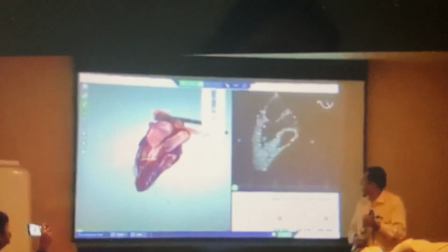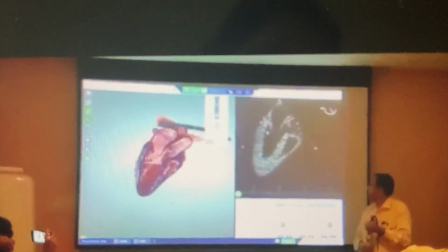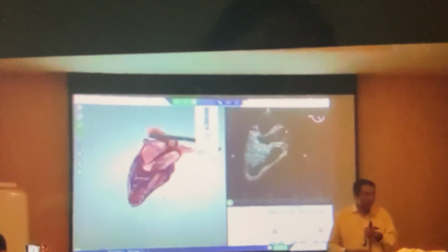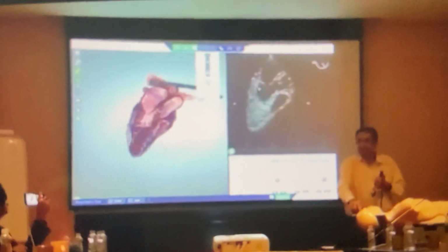The wall in between LV and RV is the anterior septum. The opposite wall is the inferolateral or posterior wall. I can see AML, PML. I can see the 2 leaflets of the aortic valve. The lower one is always RCC. The upper one can be NCC or LCC.